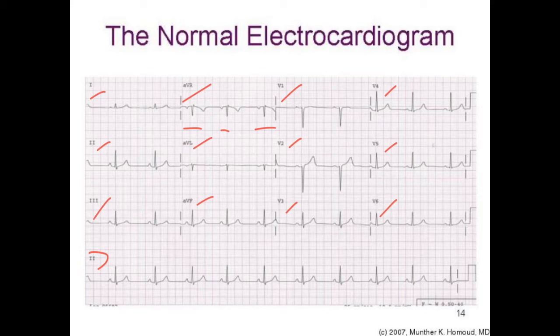When you look at an ECG tracing, you'll see these little marks. Each little mark is the start of time, and the ECG is recorded in all the 12 leads starting at the same time, which is this click mark, and for a certain number of seconds. And here you can see that we have been able to capture 3 beats, 1, 2, 3, in this block.